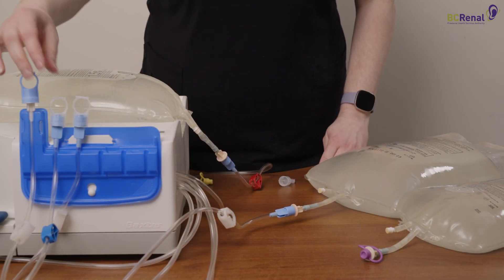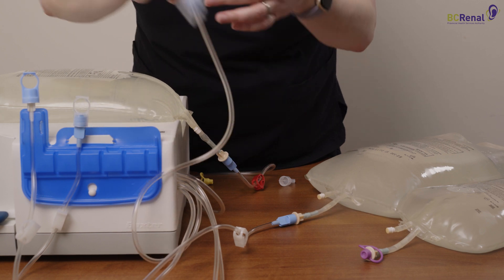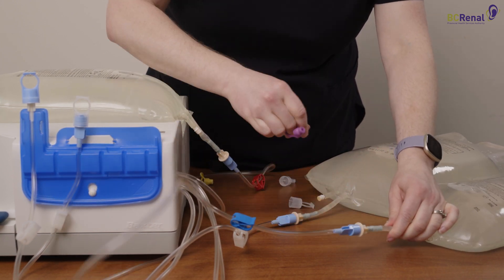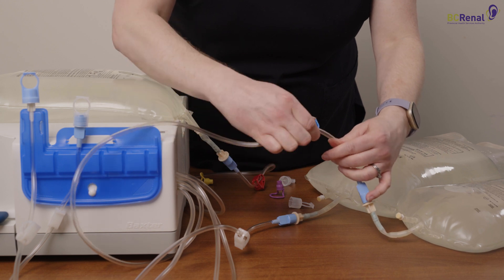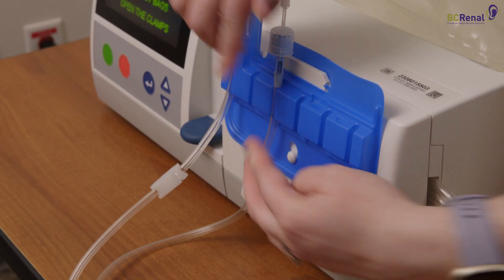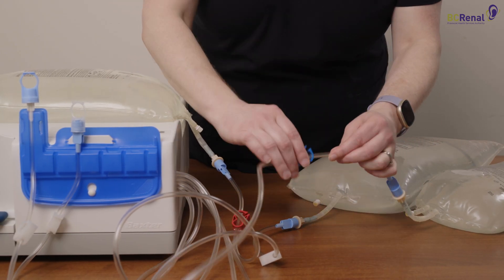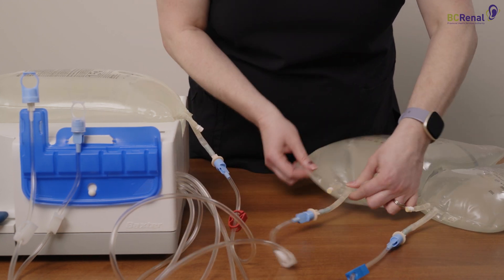If you use a different last fill solution such as Extraneal, take the blue clamp line and connect it to the special solution by repeating the same connection steps. Break the blue seal and open the blue clamp. If a line with a white clamp is not being used, close the clamp and leave the line on the organizer. As a final check, make sure all clamps are open to the solution bags that will be used, blue seals are open, and all lines are not kinked.